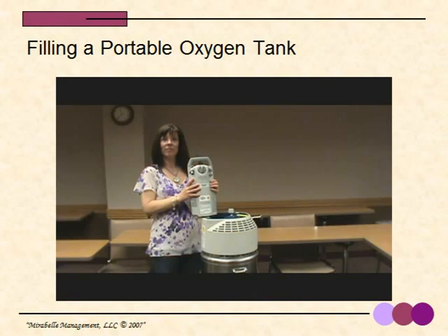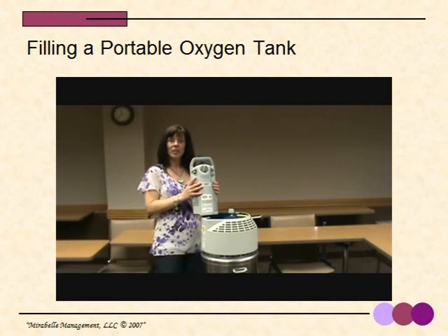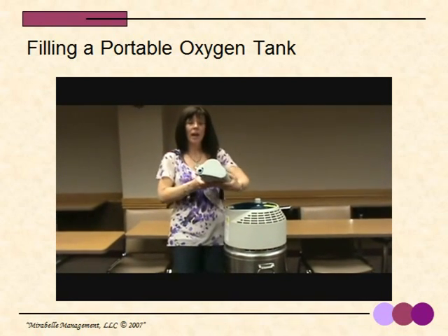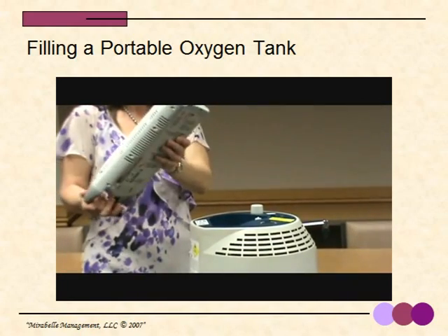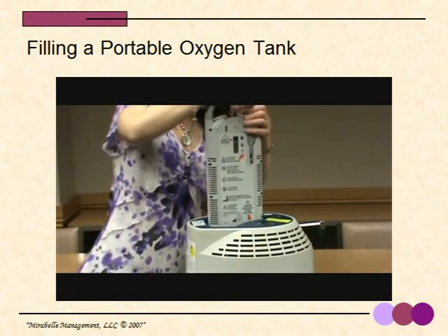Now we'll show you a video putting all of these steps together with Vicki, our nurse. A portable tank off of a liquid system. On the bottom of the portable tank is a round circle, and on the top of the liquid system is a valve that you will connect to each other like a puzzle piece and press down.